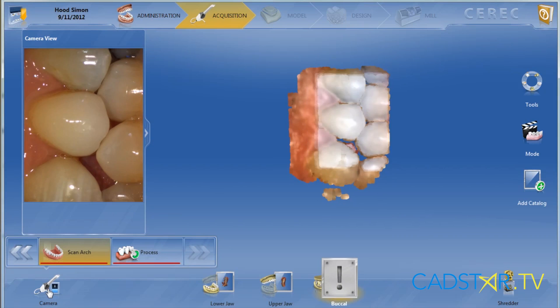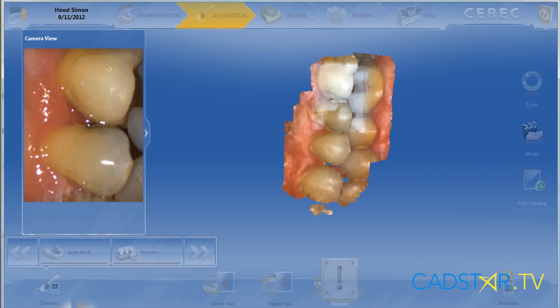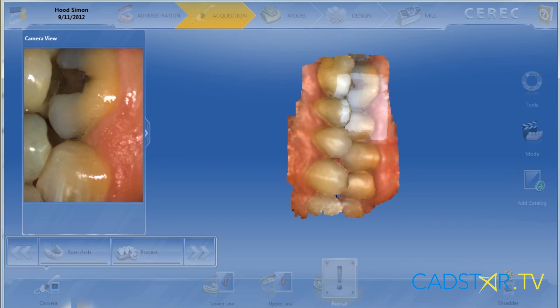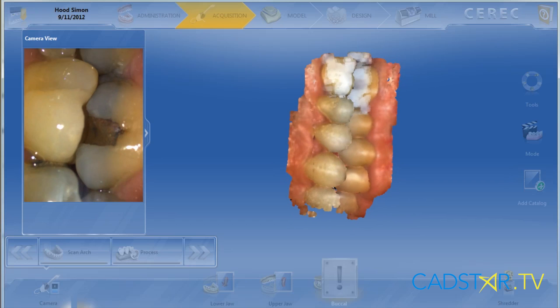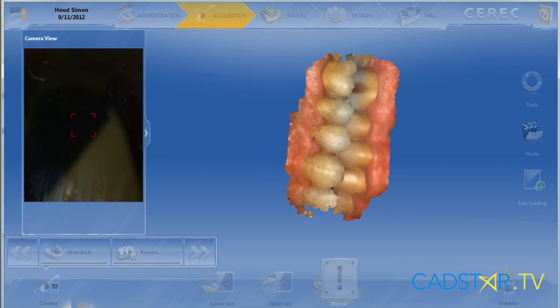With the Omnicam it's really easy to take the full quad for the bite registration. There are advantages to this — we usually can take it before we prepare. There's enough digital information to correlate and articulate the virtual dies later on. In addition, the patient hasn't had their mouth open. This will translate into a better bite registration and improve our bite with our final restorations.